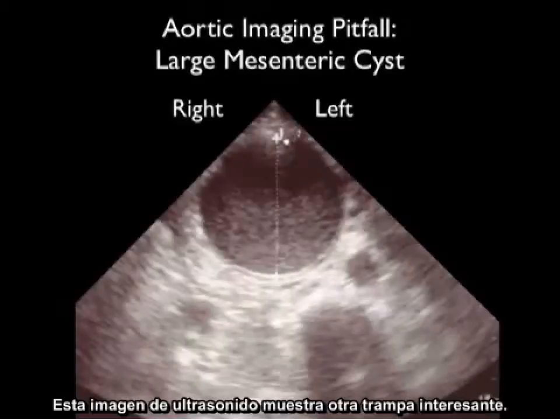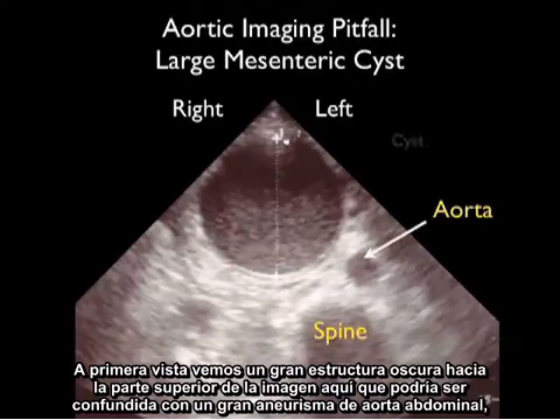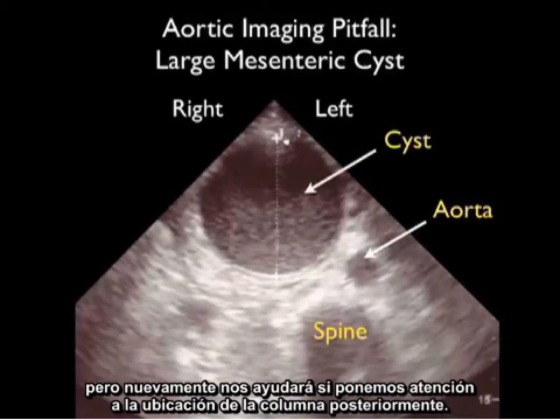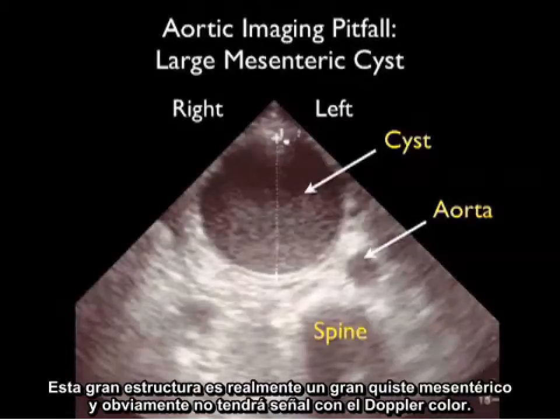This ultrasound image shows another interesting pitfall. At first glance, a very large dark structure at the top of the image could be mistaken for a large AAA. However, close attention to the spine posteriorly helps — notice the bone table of the spine, and just anterior to it, the aorta. This very large structure is actually a mesenteric cyst, which failed to demonstrate pulsations with color power Doppler.